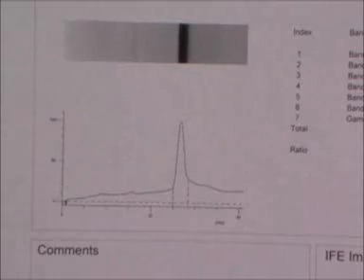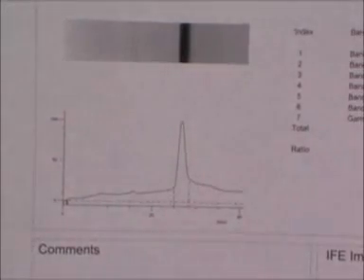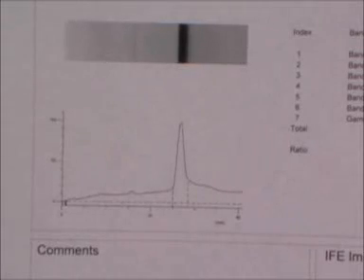In this first scan here of track 3, you can see a strong, fast running haemoglobin A band with a much slower running, much weaker A2 band.